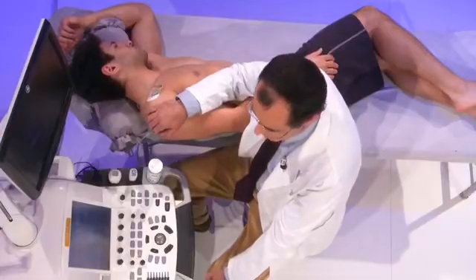Now we are going to see some clips and some images of how to do an echo and how to suspect a Takotsubo cardiomyopathy. This patient came to us with chest pain. He had a stressful event some days before, and despite not having risk factors for coronary artery disease, his ECG showed elevation of the ST segment in the precordial leads.